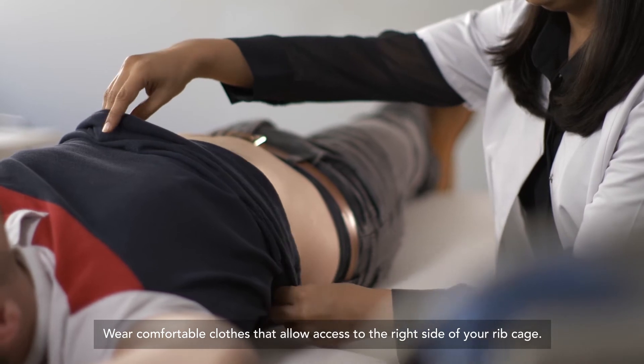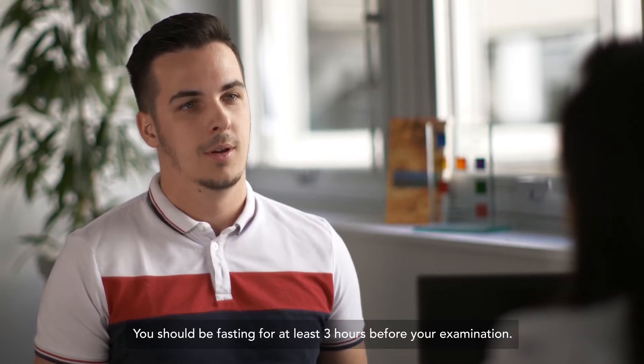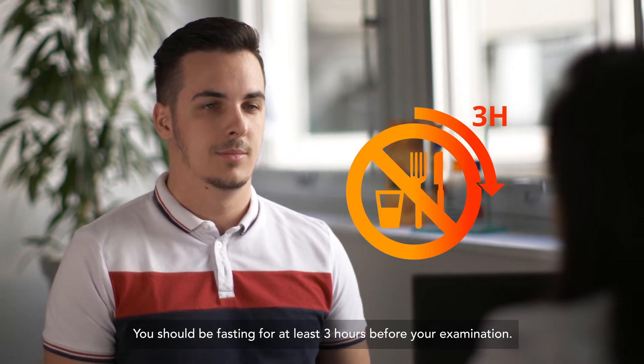Wear comfortable clothes that allow access to the right side of your rib cage. You should be fasting for at least three hours before your examination.